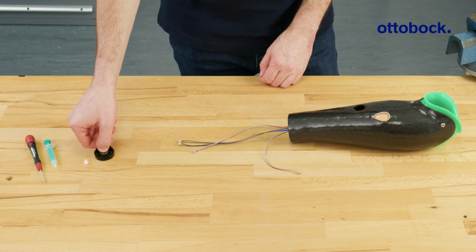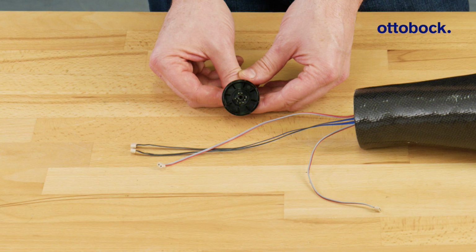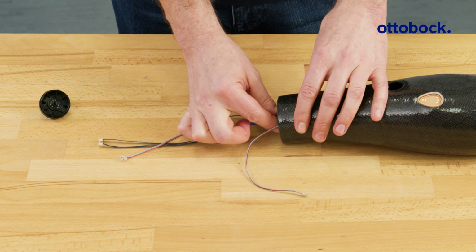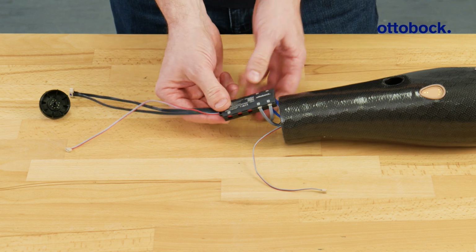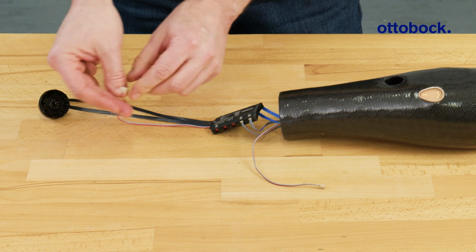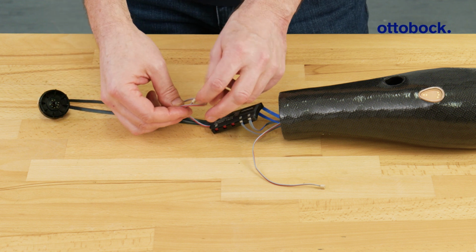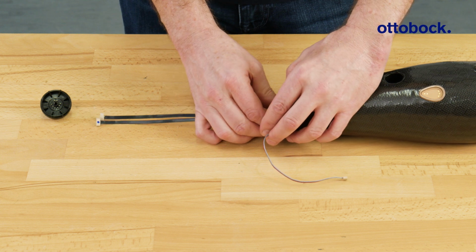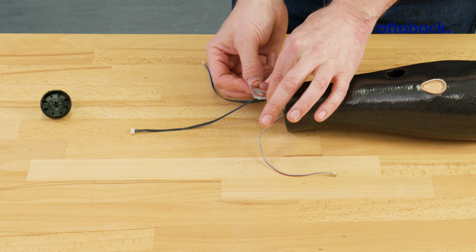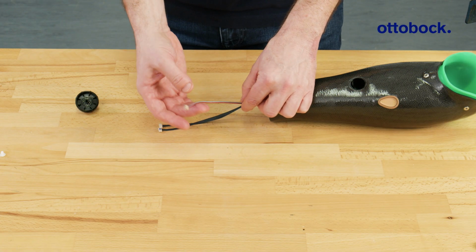In this video, you will learn how to properly wire the myosmart control unit with a transradial prosthesis and a coaxial plug. When connecting the coaxial plug, do not use the 2-pin cable of the control unit. Secure the cable in the socket with adhesive tape. The remaining 2-pole cable is from the power supply.